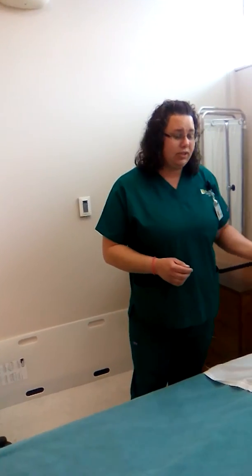Then I am going to perform hand hygiene, and then I will enter the room. I will introduce myself, I will identify the patient, and I will ask them if they have any allergies.